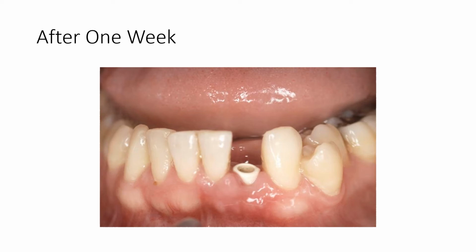This was allowed to heal for a week to let the soft tissues settle, and it's interesting also to note that the soft tissue margin, if you like, is not too far off that of the corresponding incisor tooth, because this technique is used to try and preserve soft tissue profile after immediate placement.